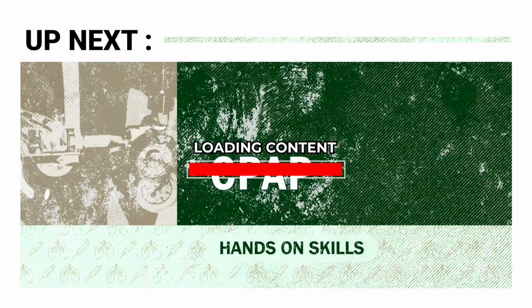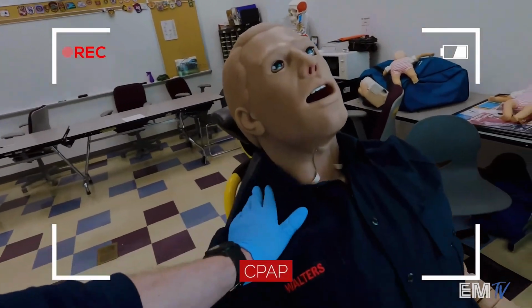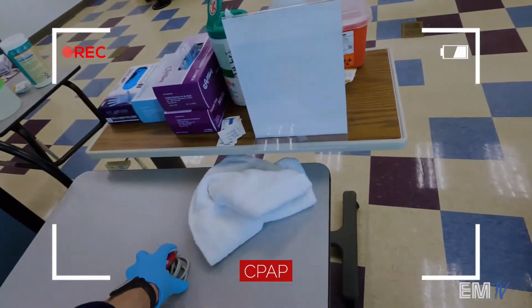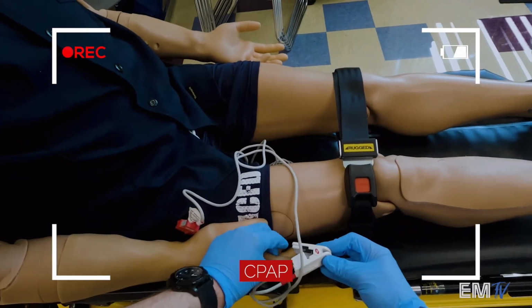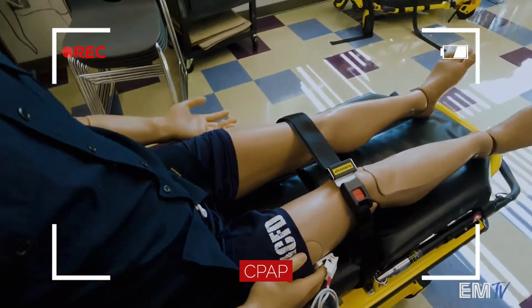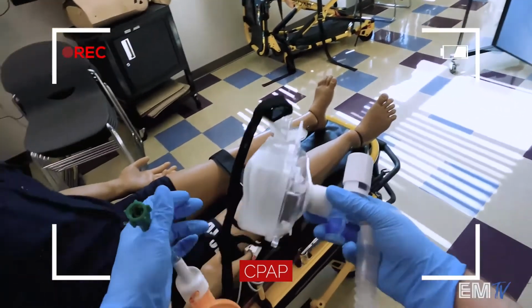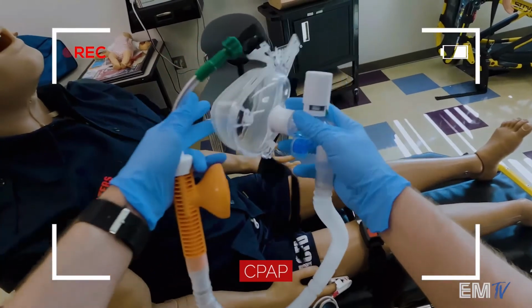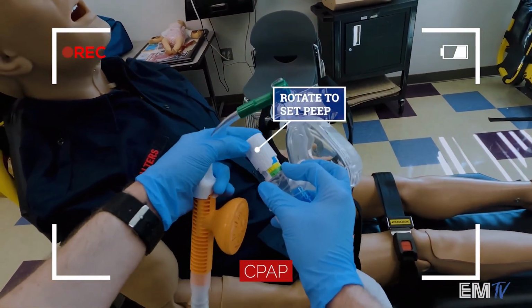Here's a hands-on video showing the application of CPAP. So to begin, what I'll first do is assure that my patient's ventilatory efforts will actually be improved by the use of CPAP. I'll go ahead and put him on a pulse oximeter and end tidal CO2. Once I've determined that my patient is a good candidate for CPAP and won't need anything more aggressive, I'll begin setting up the mask. This particular device has 3 PEEP settings. I'll set it to 5 to begin.